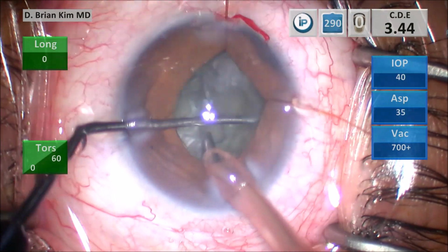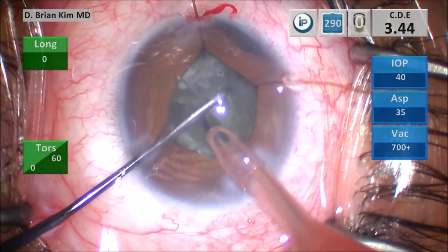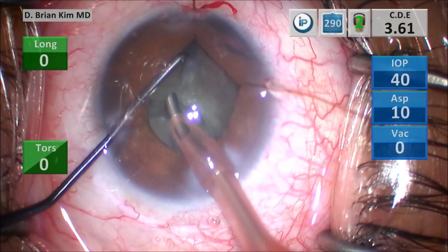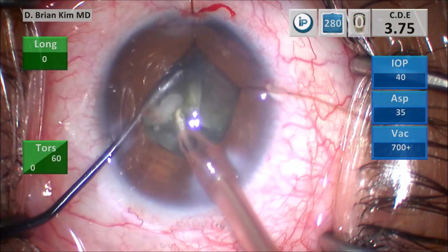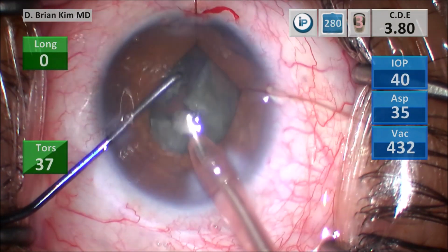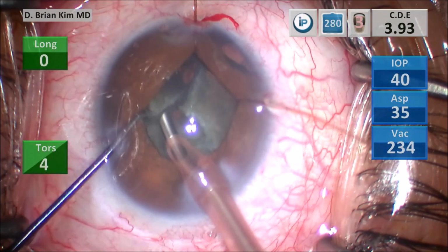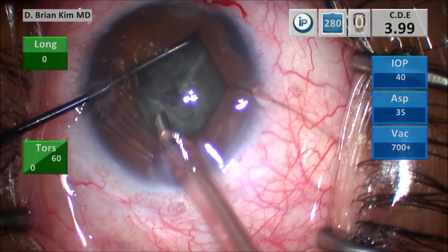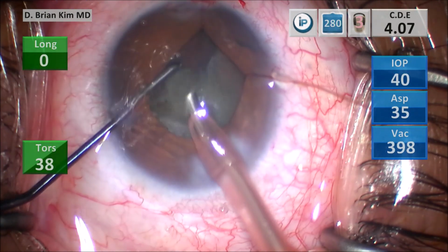Performing the cross chop, placing the chopper around the right heminucleus, pulling it centrally toward the phaco-tip and fracturing it against the phaco-tip. Using some vacuum to lift that first quadrant up out of the bag, and then emulsifying the pieces. Being very mindful not going after lens pieces with the phaco-tip.